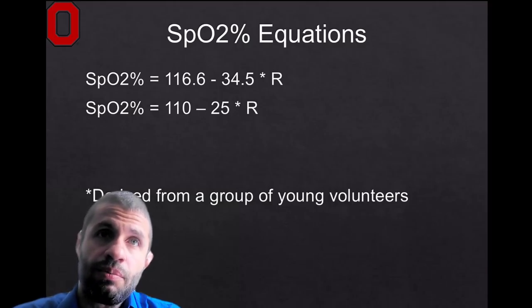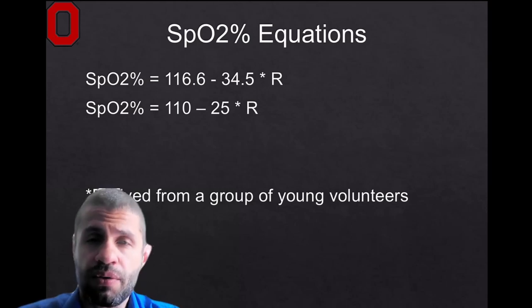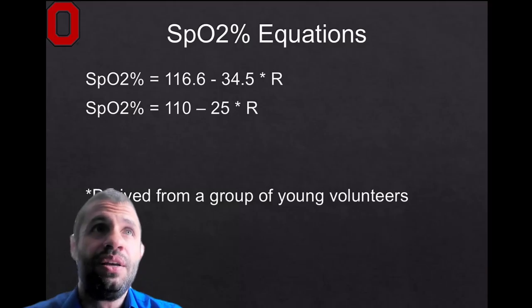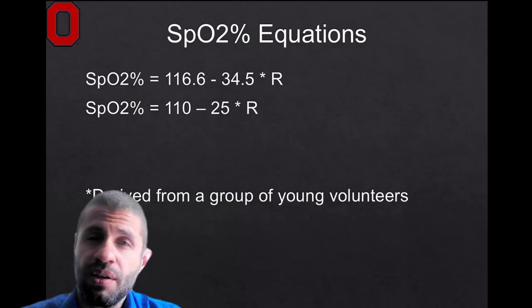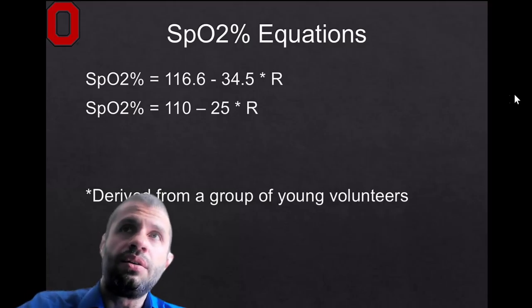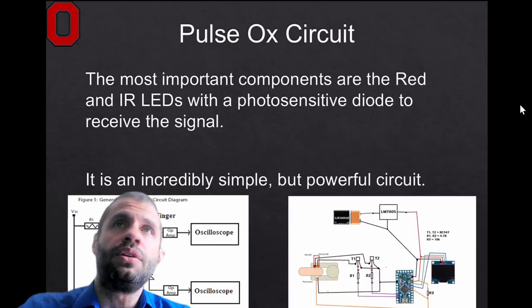And that hopefully should start making some connection between the testing, validation, and the need for robustness in how we calibrate a lot of these equations. And the answer is young people are going to be the least to use a pulse oximetry. You're going to have an aging population. You're going to have very specific groups with diseases and disorders related to heart variability or even oxygen variability. So that already should tell you that there is a bit of a bias whenever it comes to testing a lot of this equipment, and why there are a lot of regulations and engineering standards that go into this particular device.